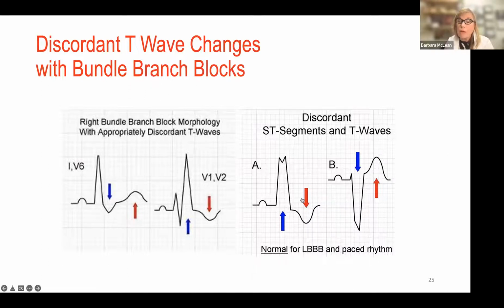And now we're going to go over here for a left bundle branch block, also the same if you have a pacemaker, because when your pacemaker is actually your transvenous pacer, the wire is typically embedded into the right ventricle. So you're going to actually activate the left ventricle in a left bundle branch block pattern. So remember, you are going to be primarily upright here in your V6. And you can see that I downloaded this visual. Oops, sorry about that.